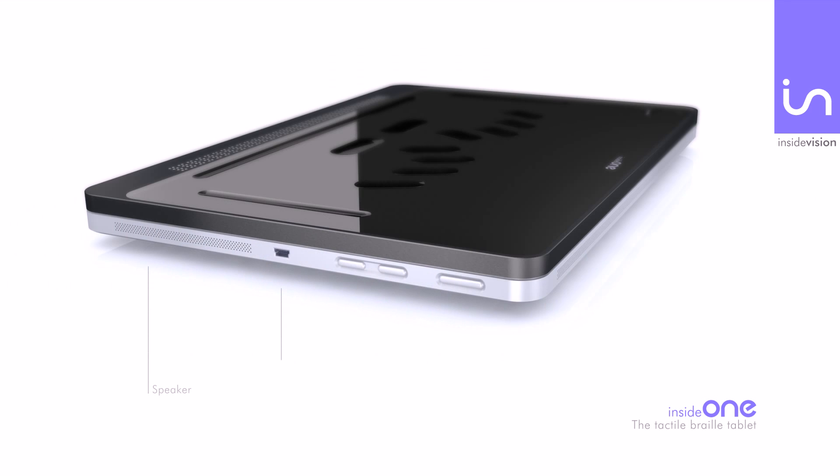On the right-hand side, from bottom up, you will find one speaker, one mini USB port, volume control, and an on/off button.